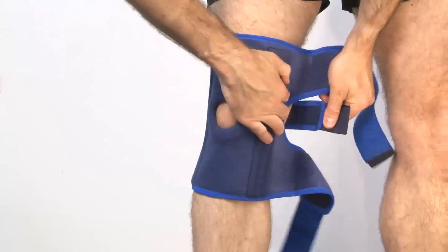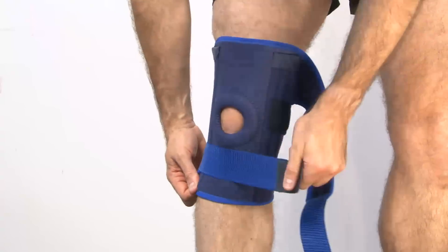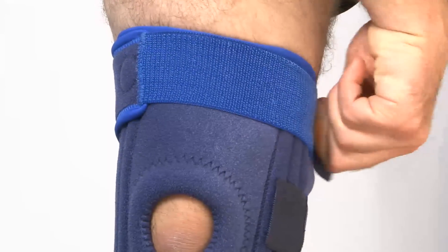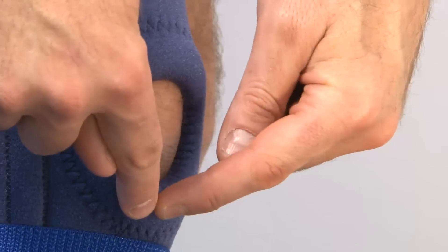The Neo-G stabilised open knee support is designed to give constant compression and retain heat around the knee joint. This one size fits most support has a wrap around design to allow for easy fitting and removal and to adjust the compression.